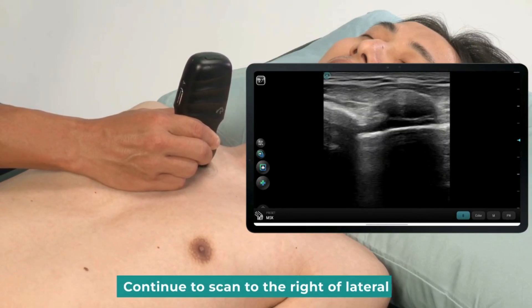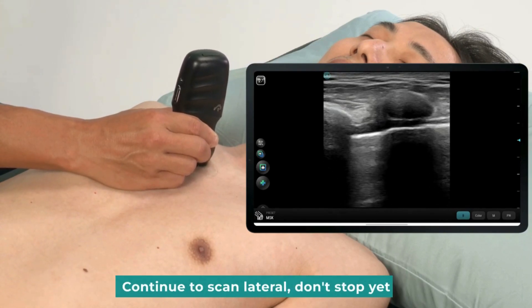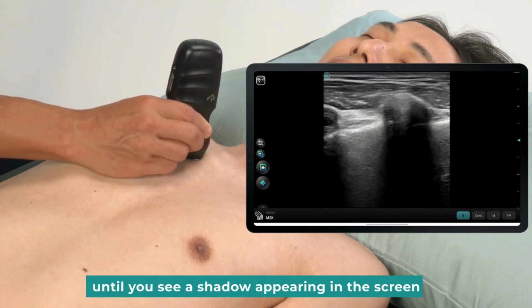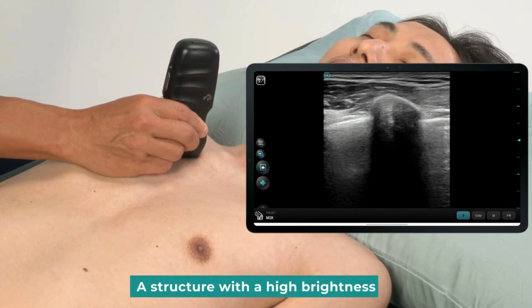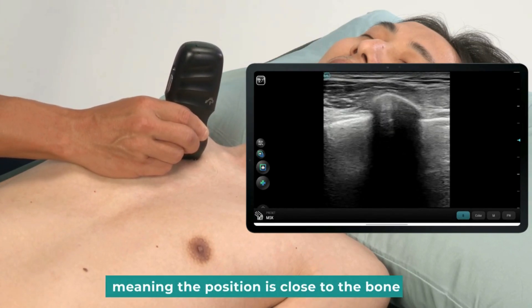Continue to scan to the right, laterally. There is an internal thoracic vessel underneath. Continue to scan lateral — keep scanning horizontally until you see a shadow appearing on the screen. A structure with high brightness means the position is close to the bone.